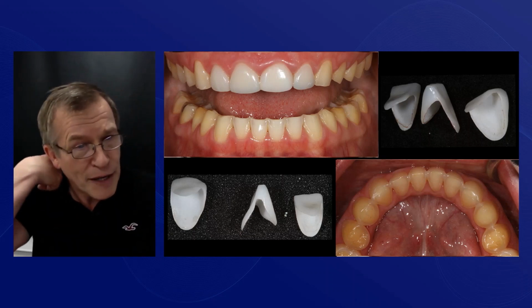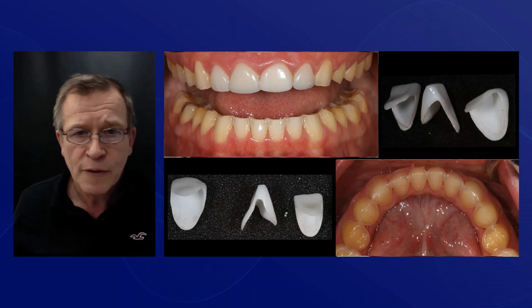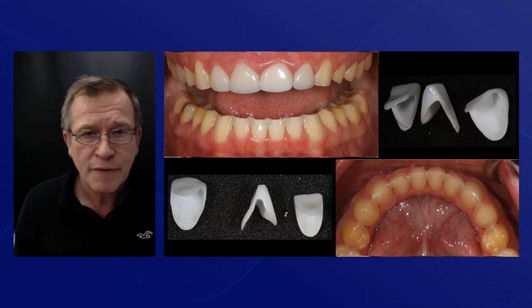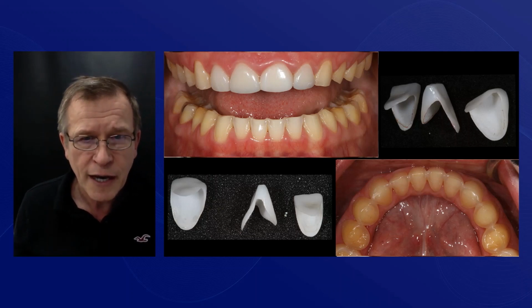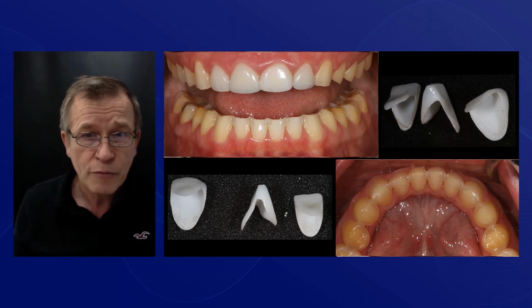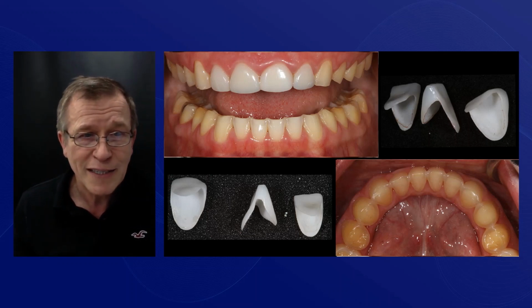So now we have the patient stable in provisionals. I like to move forward in a stepwise fashion, so we could remove the anterior 6 restoration temporaries, rescan the patient. Really nothing in the need of preparation because the patient's already prepared their teeth.